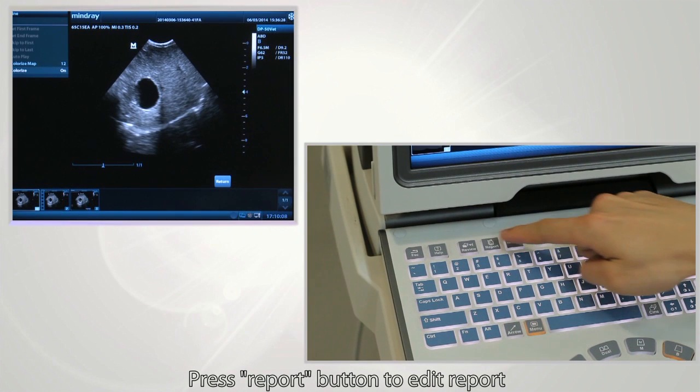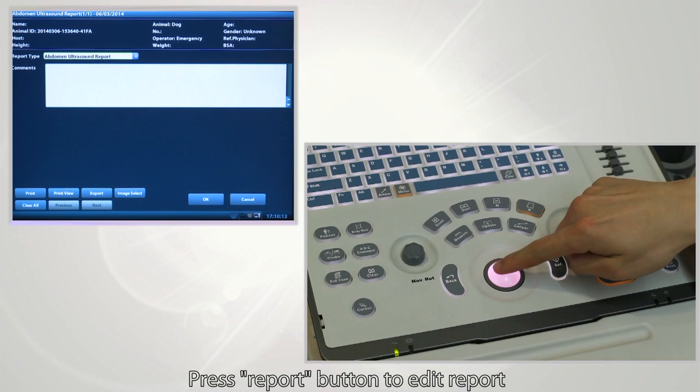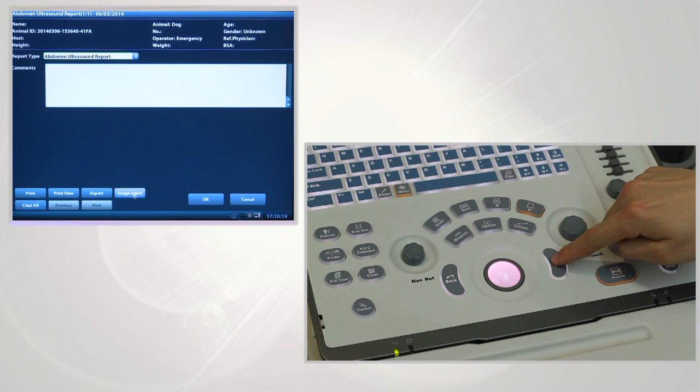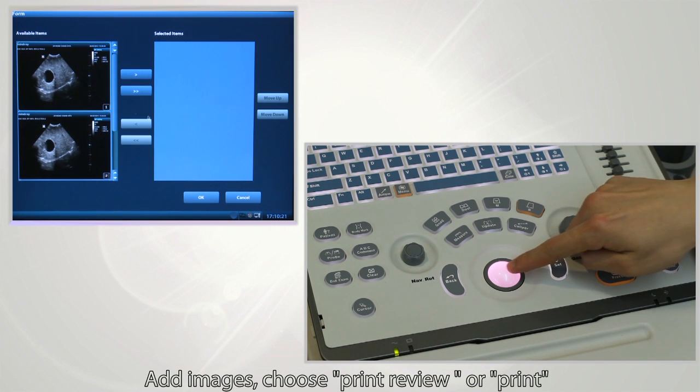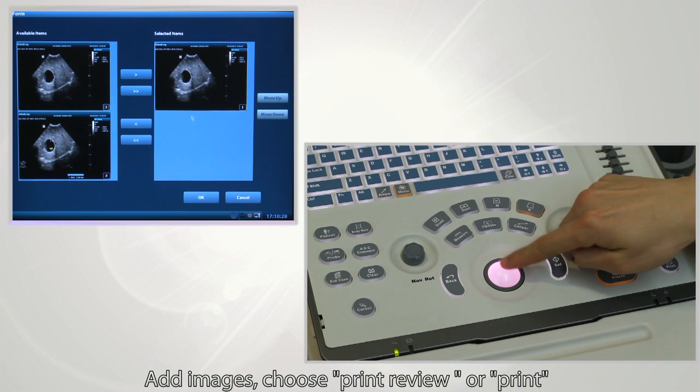Press the report button to edit the report. Add images and then choose to print or review.